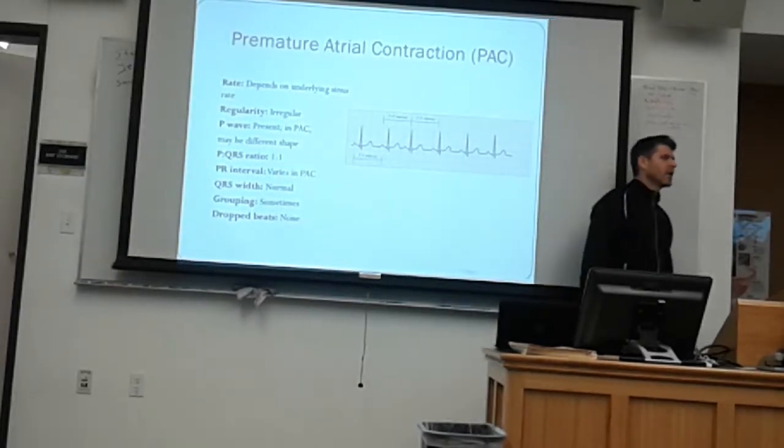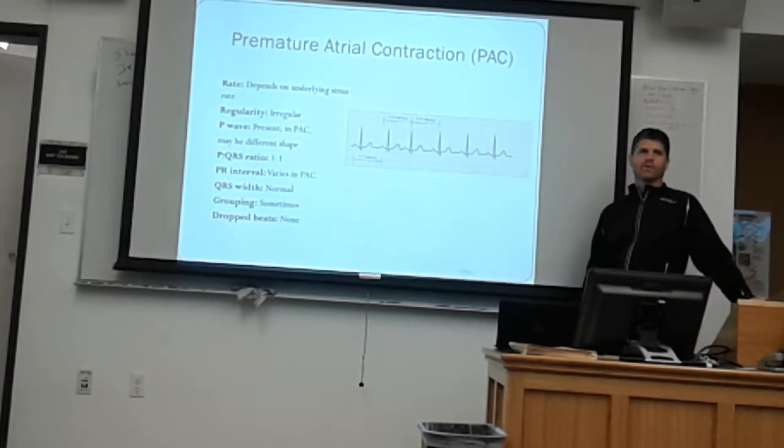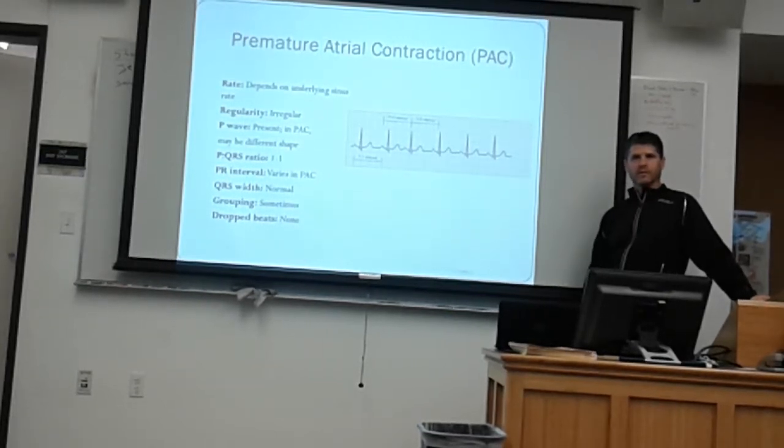And what kinds of premature atrial complexes could we have? Conducted versus non-conducted. What does that mean? So, conducted: QRS versus no QRS.